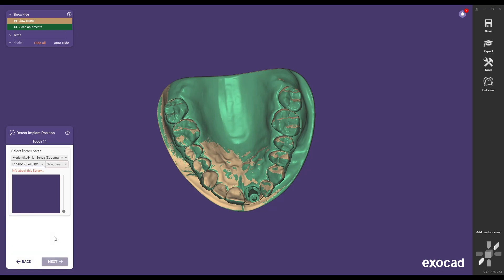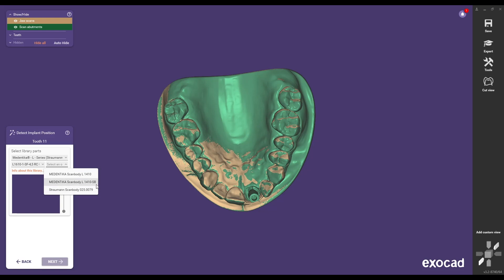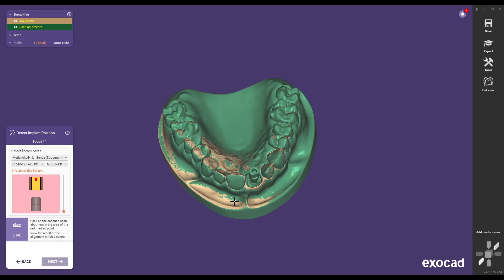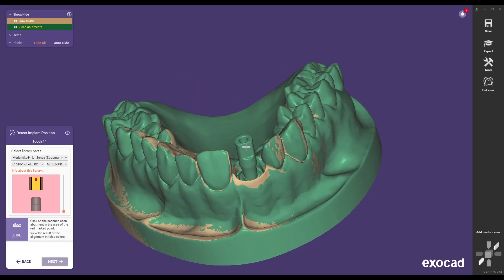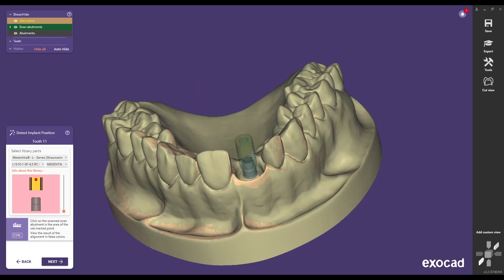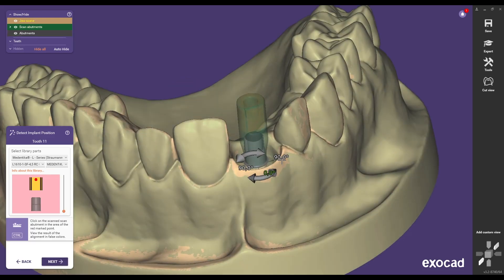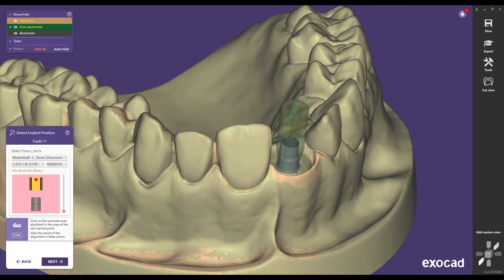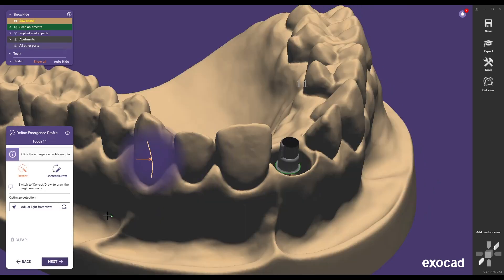Select the scan body present in your scan file. Ensure you select the correct scan body to ensure a precise fit. Medentica offers both the previous generations and latest minus SB scan bodies which are similar to the Straumann metal scan bodies. After matching the scan body the Titanium Base ASC Flex is positioned directly in the jaw.